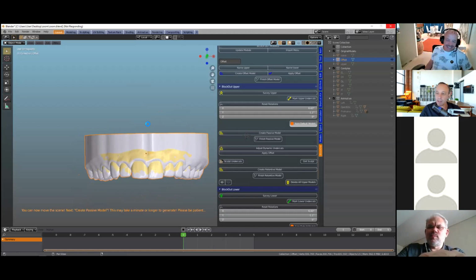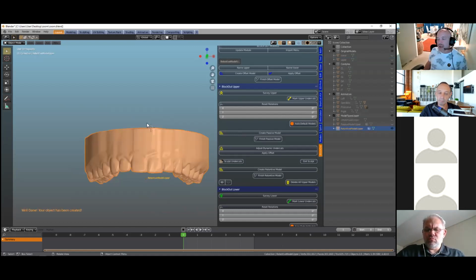So Michael, there was a question earlier regarding that auto articulator button. Sometimes we set the X value to 1 millimeter for Bennett side shift. Will the auto button set that as well? As far as I remember, I have it set that as well. Yes. Okay. But yeah, so it's getting to know the articulator and how it works.